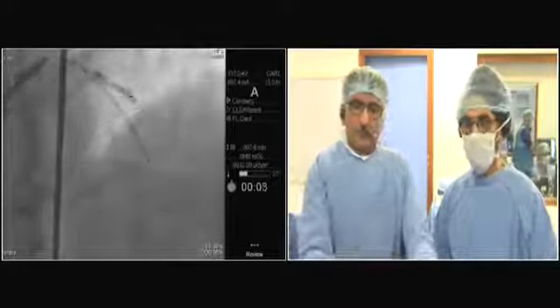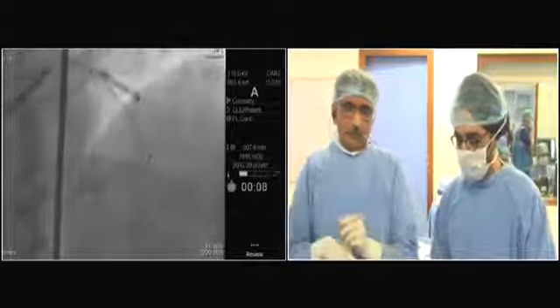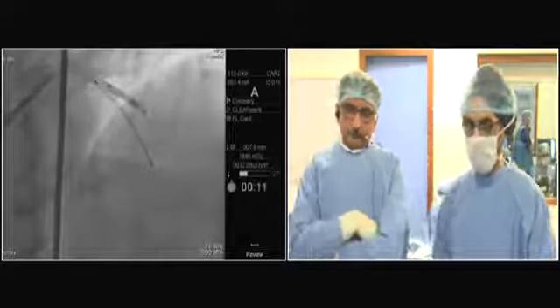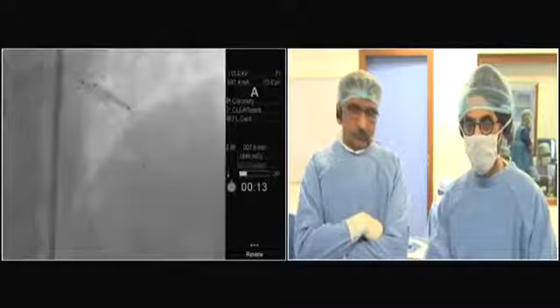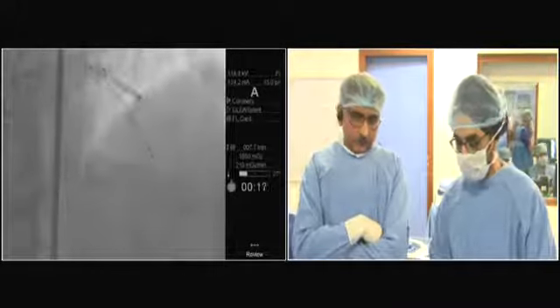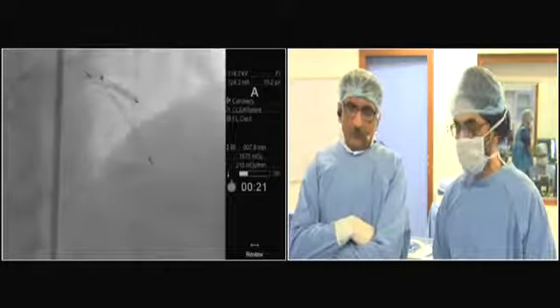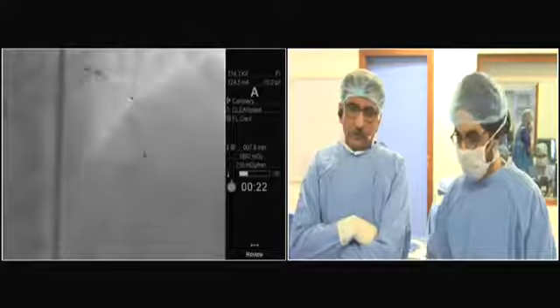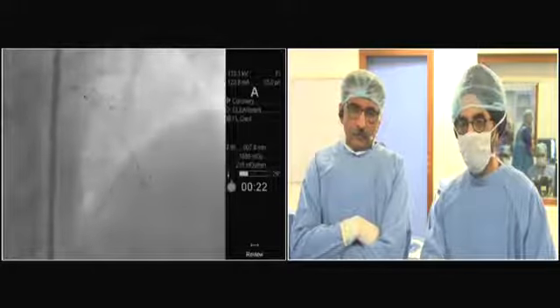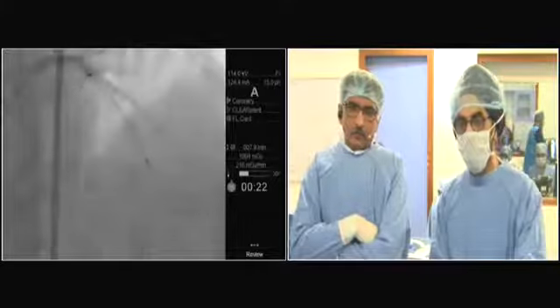So we have dilated the diagonal stent first. It won't be a DK crush. It's a mini crush. A single kissing mini crush. Yes, right. No, I will do a final kissing, of course. So for a DK crush, Xiaoliang will say probably, you put the stent in the side branch and you crush with the balloon in the main vessel, and then you come with the second stent.